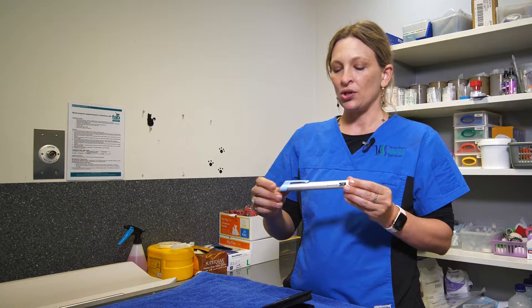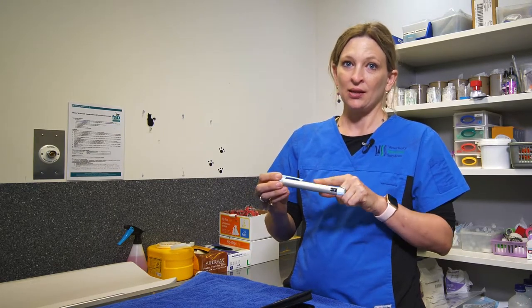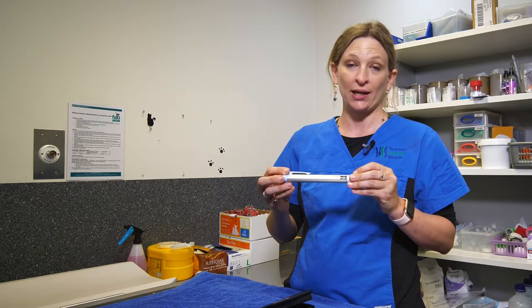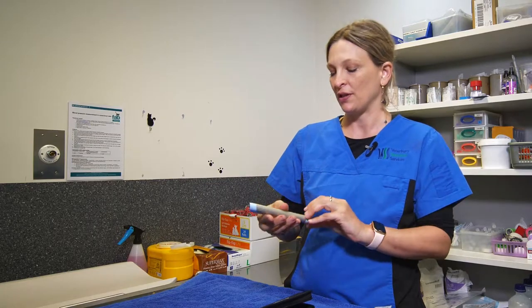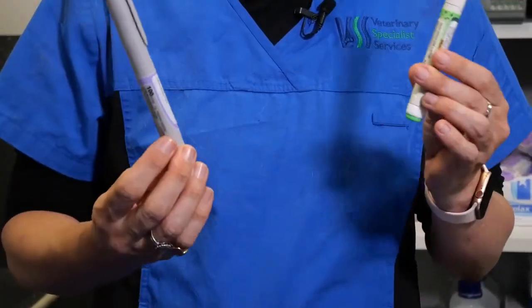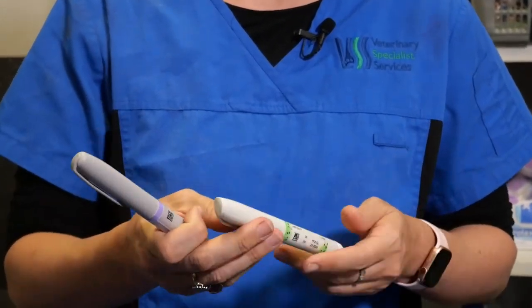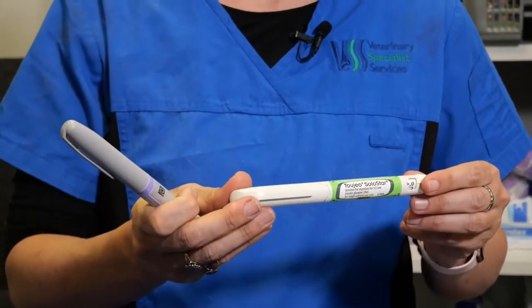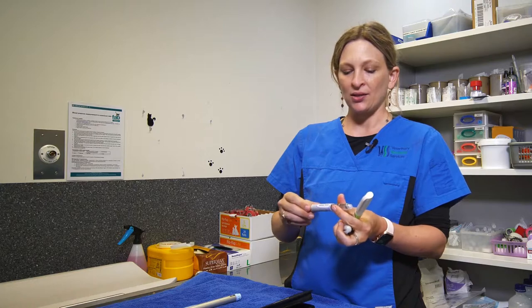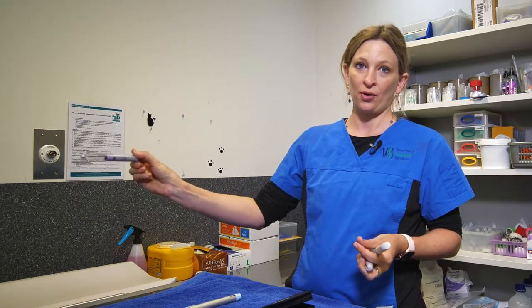It's important that you don't put the pen into the fridge, as the cold of the fridge can affect the mechanisms of the pen and that might affect the delivery or the accurate delivery of the dosage of insulin. There are other pens available for glargine insulin — this is the Lantus Solostar and the Toujeo Solostar — and these are essentially disposable pens, so when you've used this pen up, you throw the whole thing out.